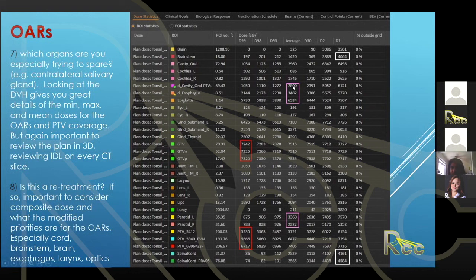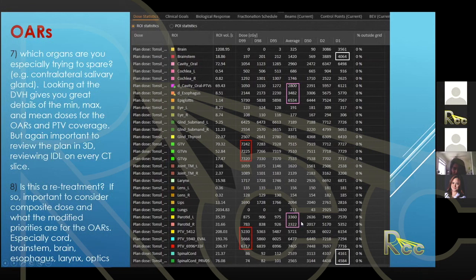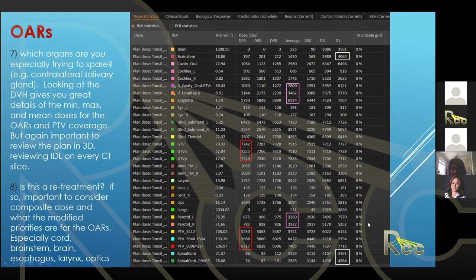We also look at average doses for the oral cavity minus PTV, keeping esophagus below 35 Gy, and evaluating epiglottis, parotids, and so on. D1 — 1% of volume receiving this dose — is good for structures like brainstem, spinal cord, and optic structures. This DVH review should always be done in conjunction with scrolling through each CT slice to make sure everything looks okay and coverage looks good.